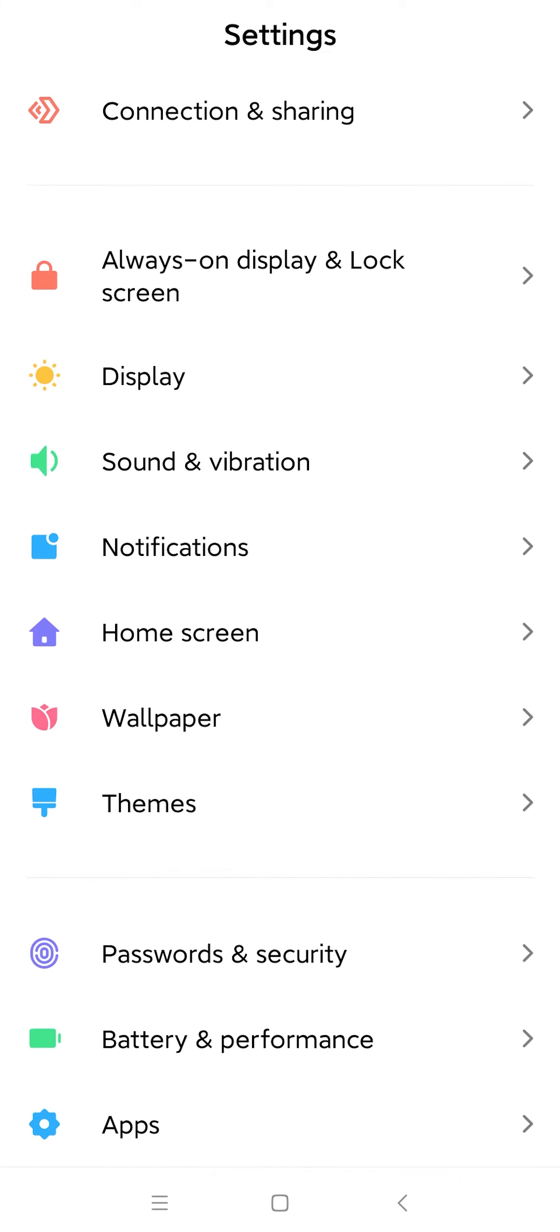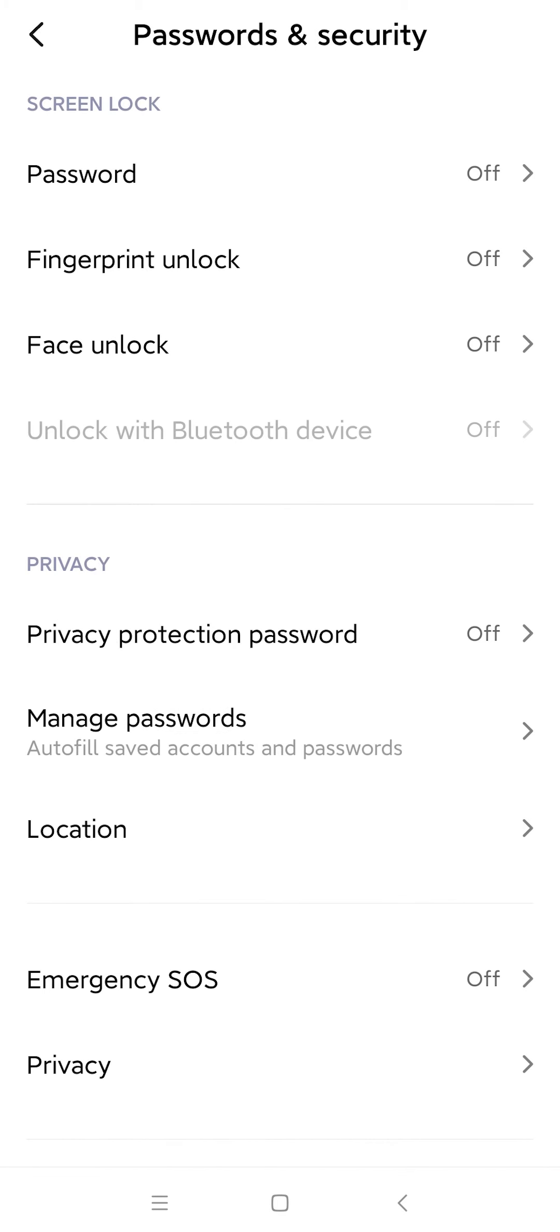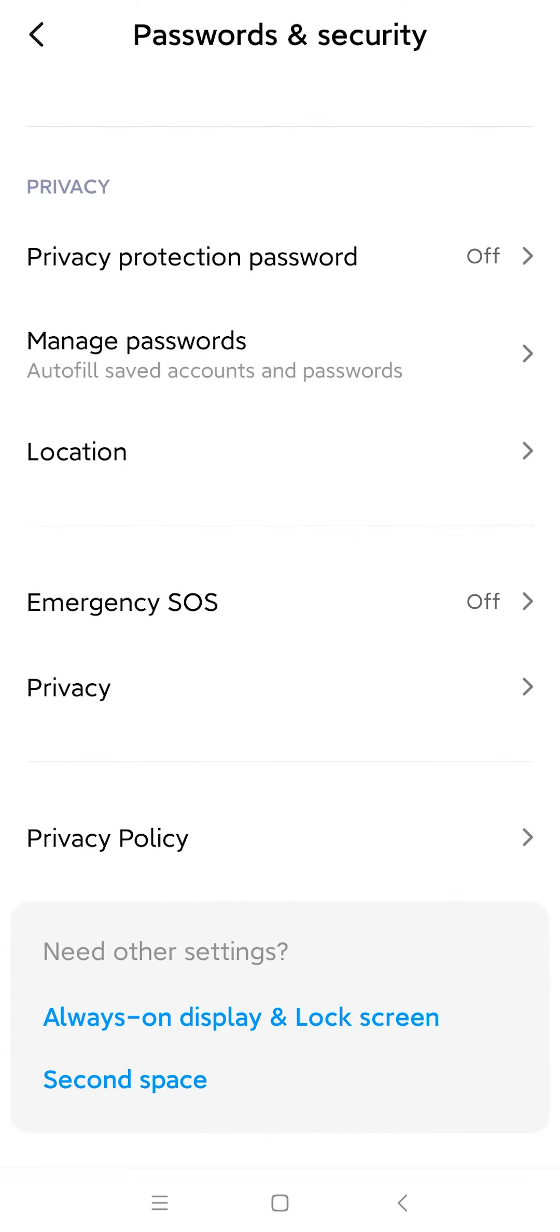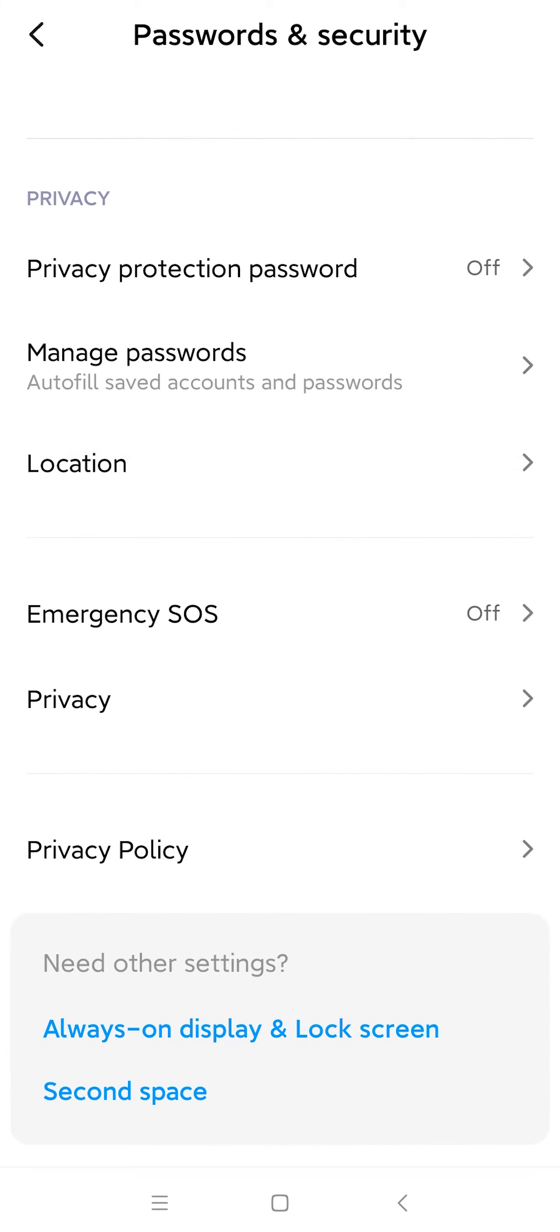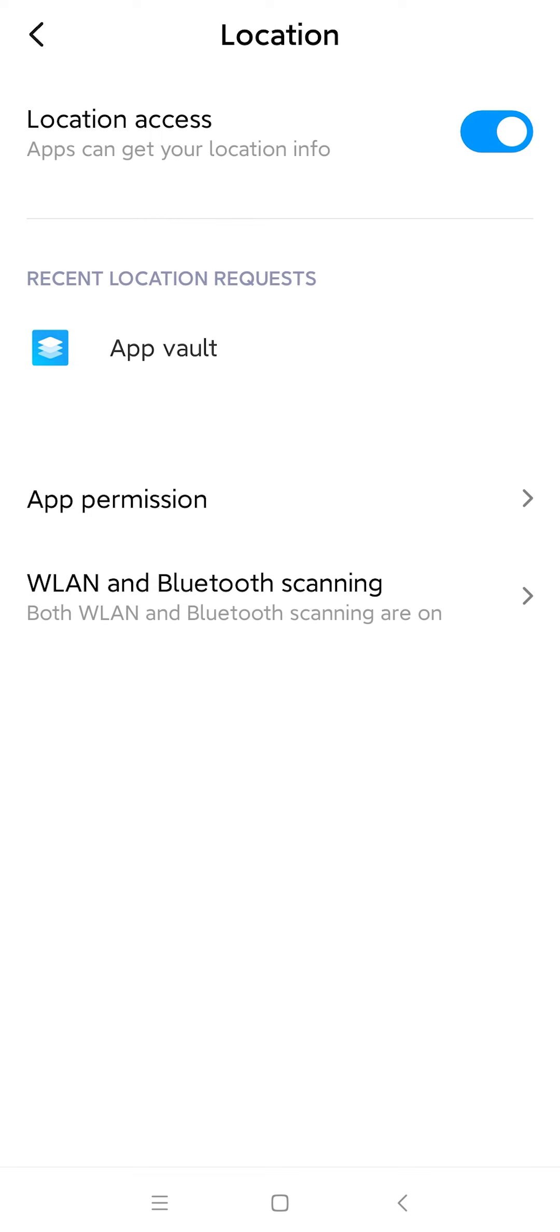Find and select the Password and Security page. Scroll down to the bottom of the window and find Locations. Make sure the location access is always switched on and go to App Permission.